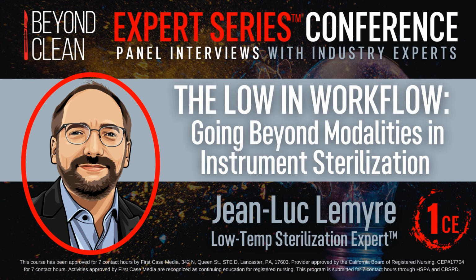But after launch, if additional validation is done, it takes a long time for a med device manufacturer to update their IFU. So sometimes the validation exists, it's out there, but it's not in the IFU, and it would come in the form of a customer memo most of the time, which acts as an extension of the IFU in this case. Something related to this is that the validation of compatibility does not have to be the sole responsibility of the instrument manufacturer. It can also be done by the sterilizer manufacturer. That is something that has been addressed in the latest version of ST91.